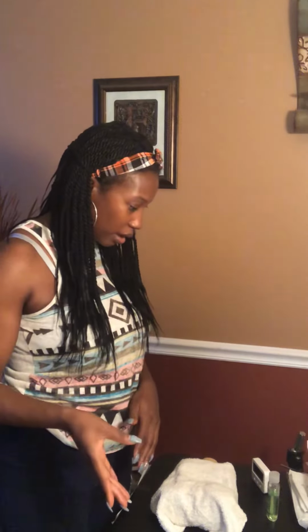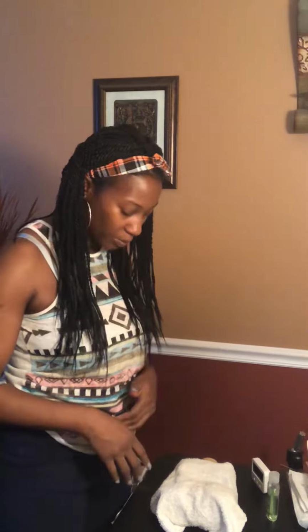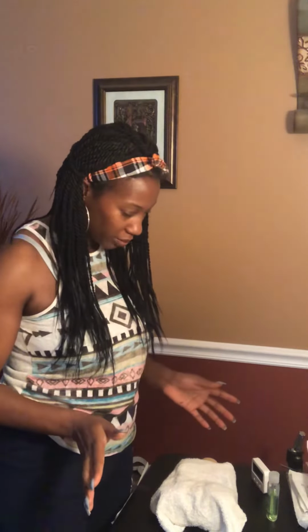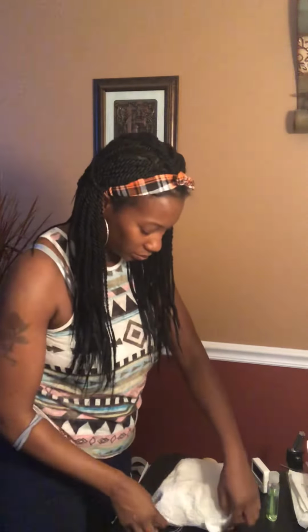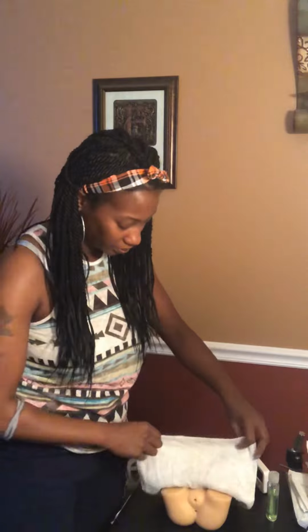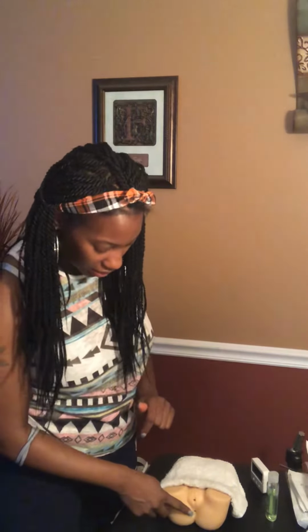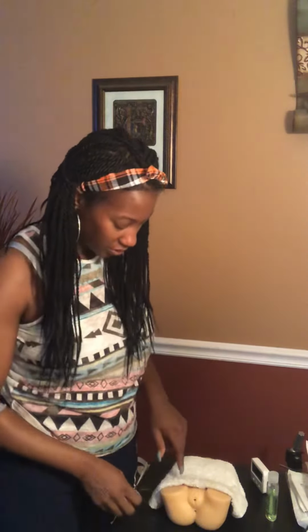Okay, so I'm going to do an intermittent urinary catheterization per doctor's order. You had some residual there. So first, I'm going to drape you. I'm just going to gel my hands again. I'm going to drape you, provide privacy. So, as you can see, this is the vagina and this is the anus.